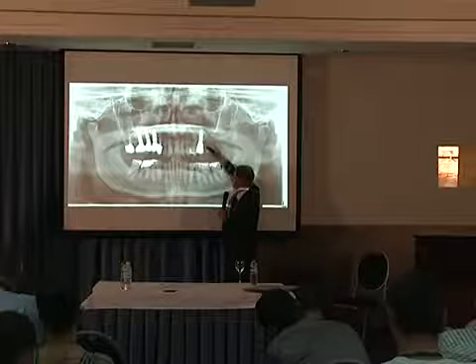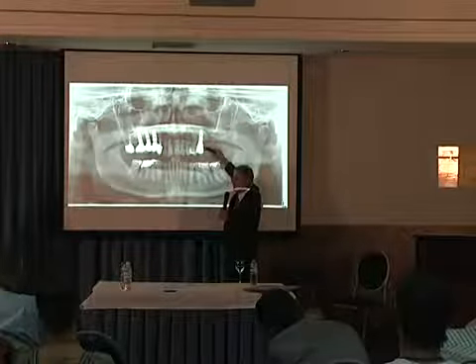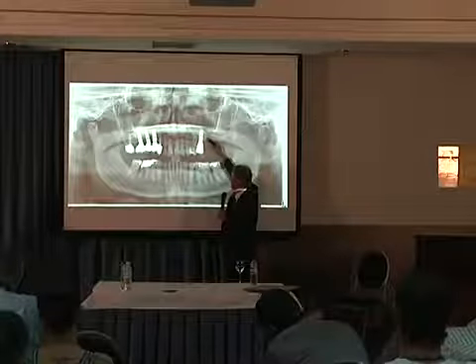5-6 years ago. The tooth was at that time available. Then tooth infection, extraction and bone defect.